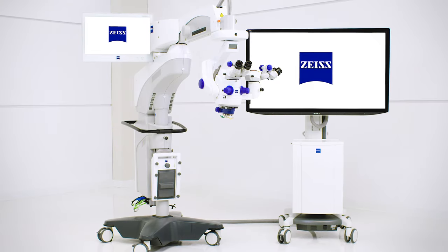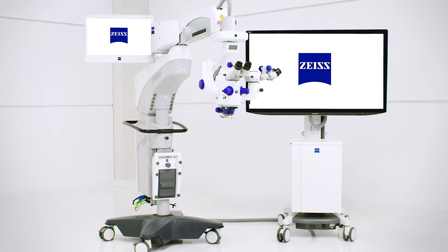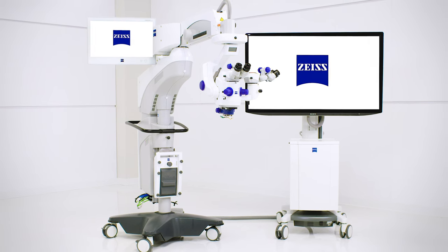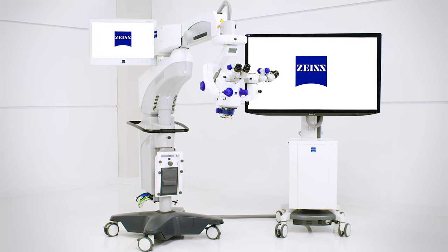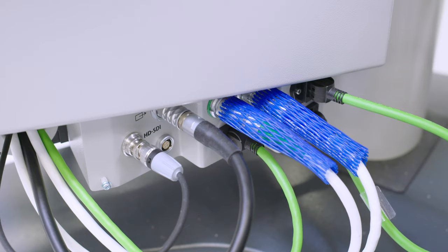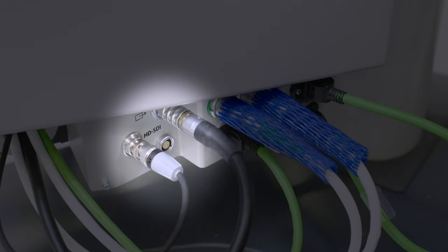The procedure to pair the wireless foot control panel is essentially the same for the OPMI Lumera 700 and Artevo 800 microscopes from Zeiss. When pairing the microscope with the wireless foot control panel, first make sure the CAN cable is not plugged into either the wireless foot control panel or the microscope. If the CAN cable is plugged in, you can't pair the microscope with the foot control panel.